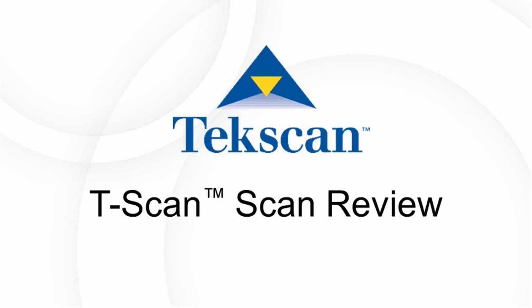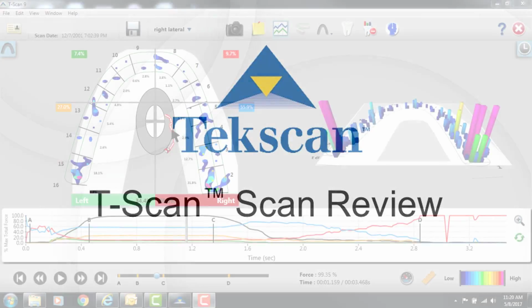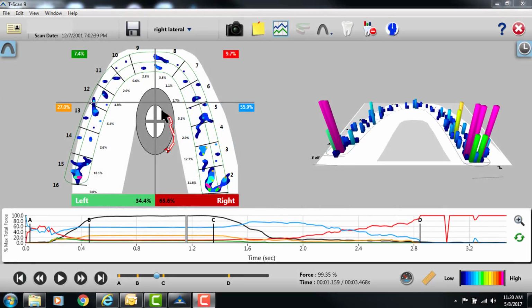Welcome. In this demonstration, I want to show you how we could do an adjustment to make the center of force icon move closer to the middle. This is assuming that the patient has all their teeth, or at least 2 through 15, available for adjustment.